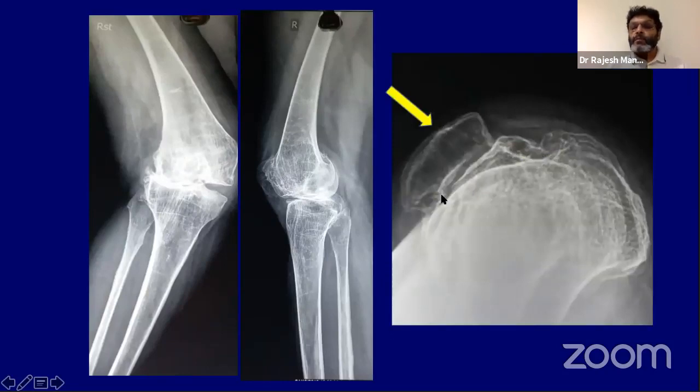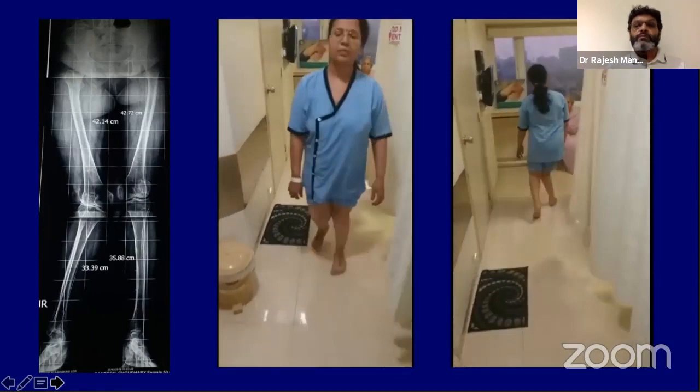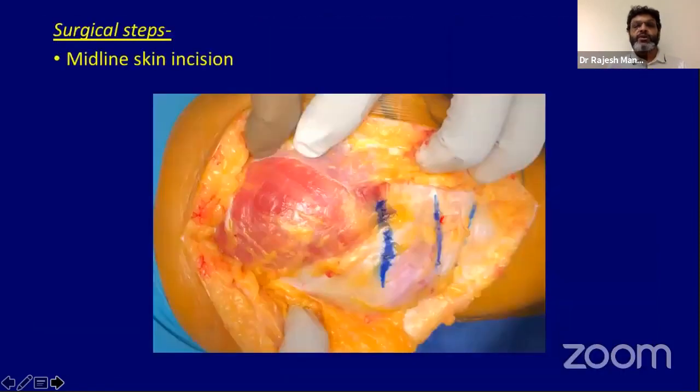And throughout the range of movement, that's where it stayed. This is the long leg X-ray, which I think must always be done in any severe deformity, particularly all valgus patients. Here is our preoperative video. Standard severe valgus, partially correctable.